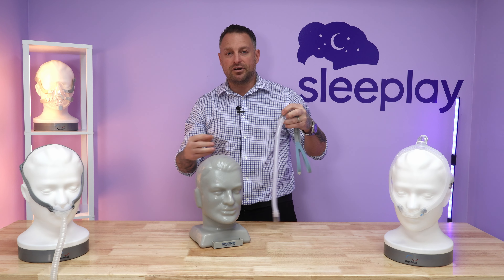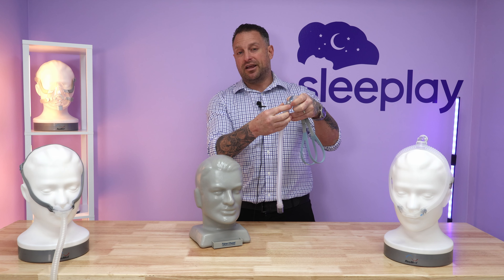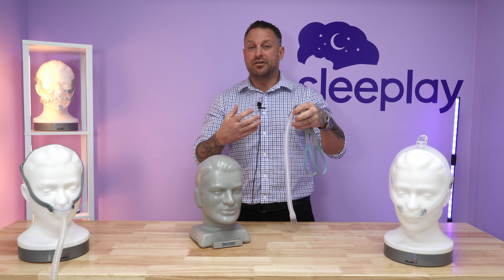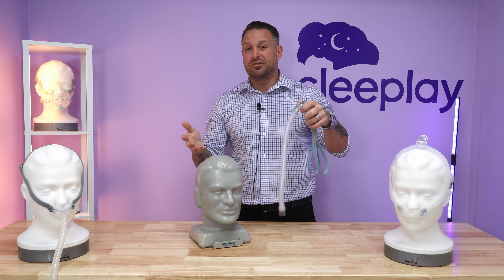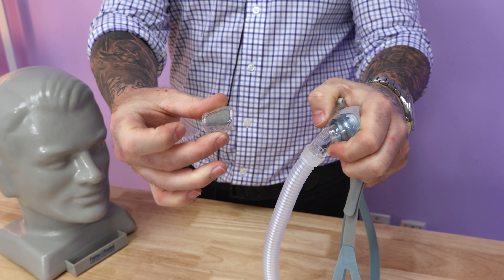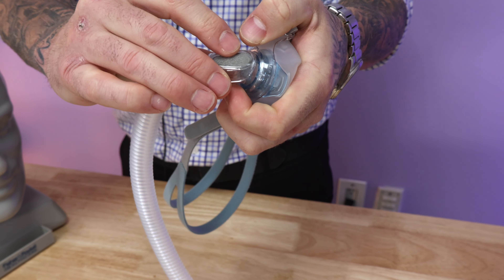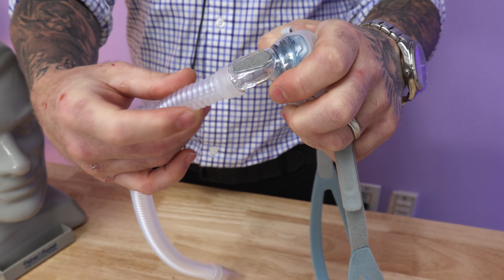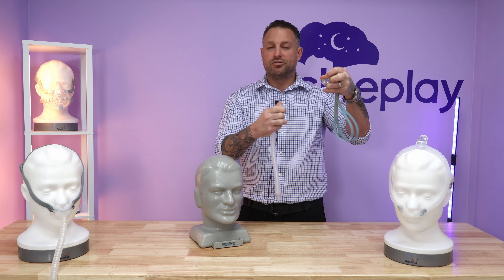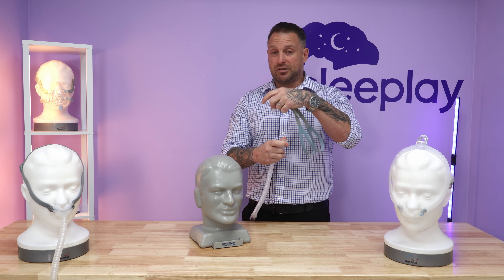This likewise has a foot extra of tubing. It also has an extra filter, which comes in handy. Some people like the extra filter for sanitization — they feel a little better breathing in the air like that. There's a filter on the machine of course, but this one has an extra filter. You just pop it off — you can purchase these separately about every six months. You can keep it off or just snap it back on. This actually pulls out of here, so if you wake up in the middle of the night, you can just pull this off.